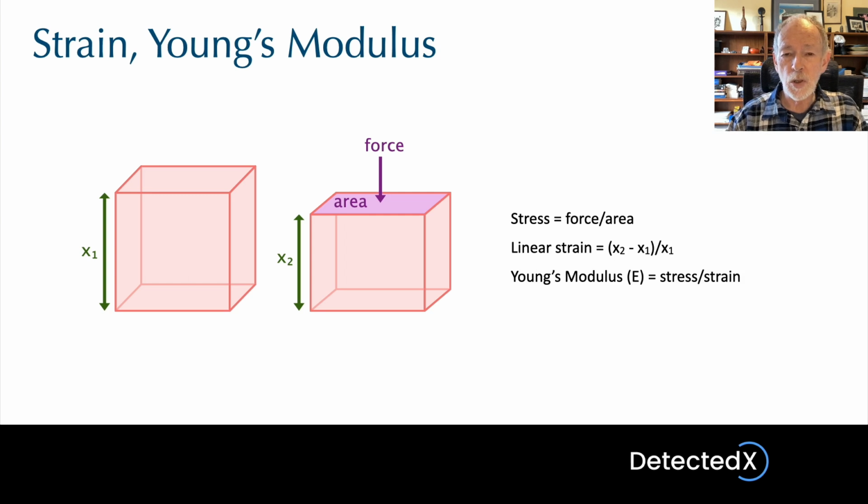We use the word stress to describe the force per unit area. Now this, of course, is simply what we mean by pressure, force per unit area. So the stress really has the same dimensions as pressure, and indeed stress is measured in pascals, in the standard units that are used to measure pressure. So that's stress. It's the applied force per unit area.